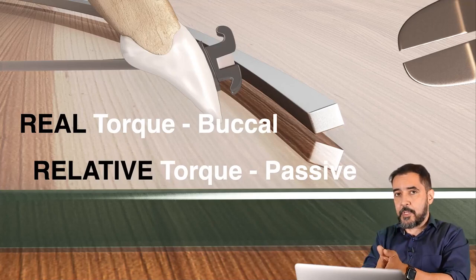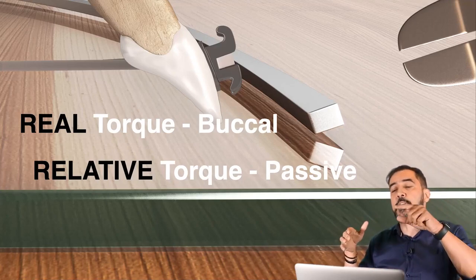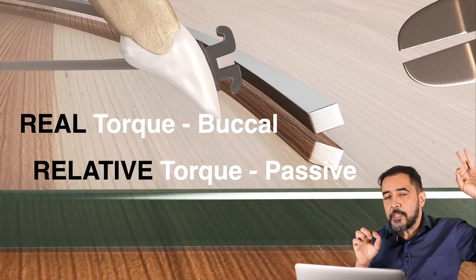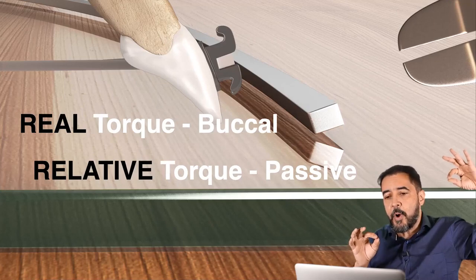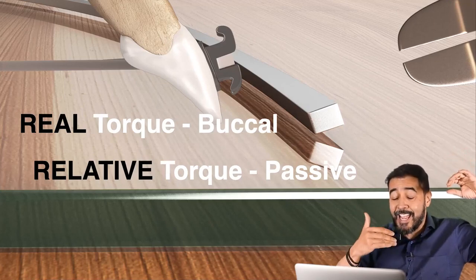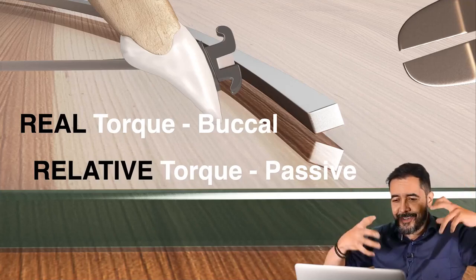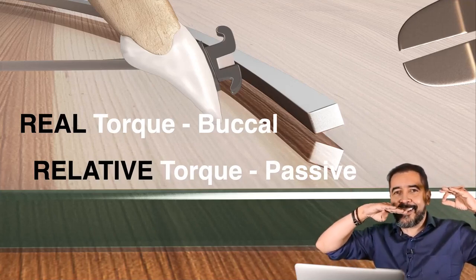Very important. Every time you do this in your patient, you have to apply this kind of concept. If you don't want to change the inclination, if you don't want to change the position at that point, you have to do this reading of the position. You have to assess the position of the tip of our rectangular arch wire inside our slot.